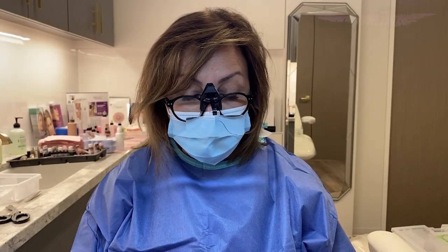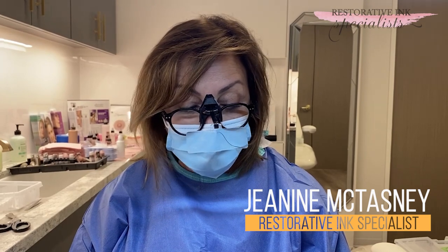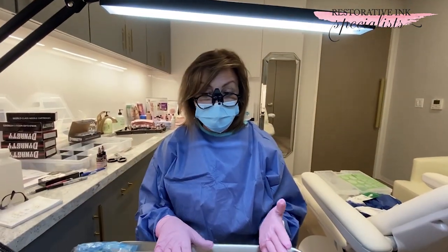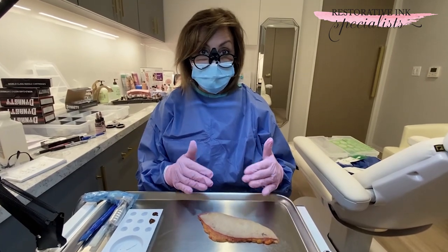Hello, I'm Janine McTasney. I am a nipple and areola tattooist for post-mastectomy patients. Today I am working at a clinic where I just got a piece of skin from a surgical site, and I wanted to demonstrate what happens when we actually implant needles into the tissue.